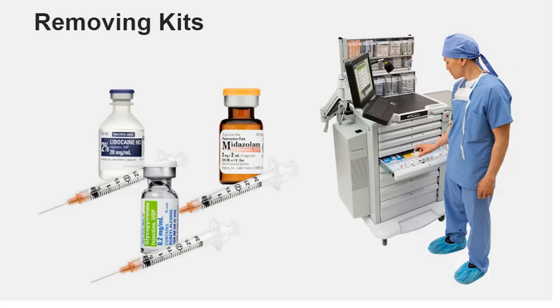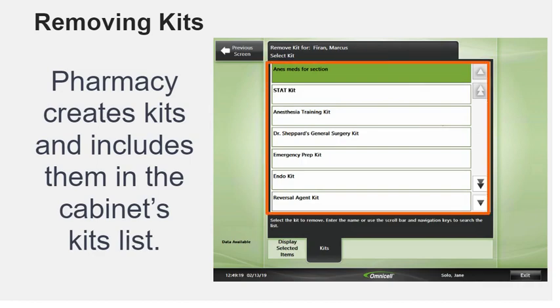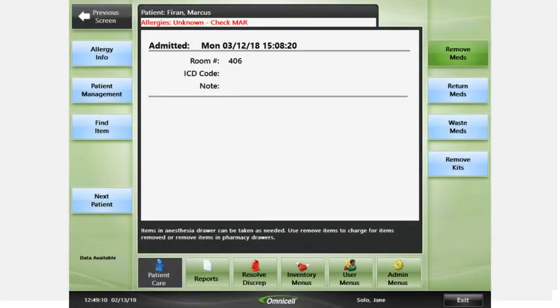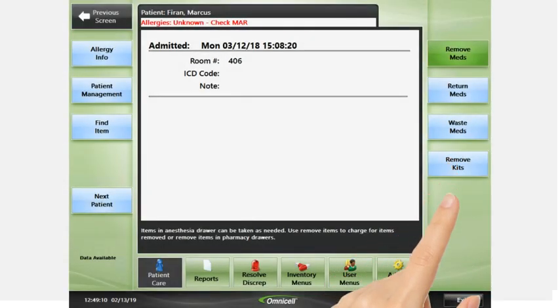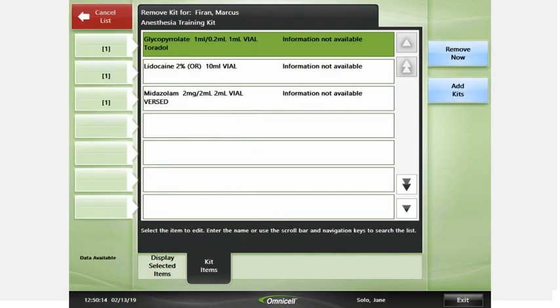Using kits to organize the removal of medications for cases simplifies the setup for a case. Requests for kits may be submitted to the pharmacy, which then creates kits and includes them in the cabinet's kits list. To remove a kit, from the patient screen, select your patient, then press Remove Kits. Select the desired kit. If you want to add another kit, press Add Kits. Press Remove Now.